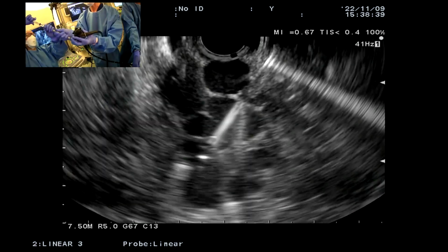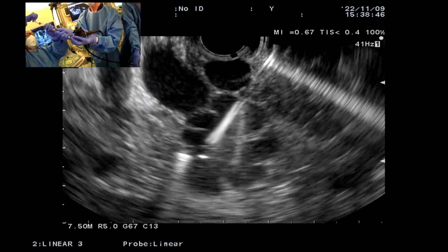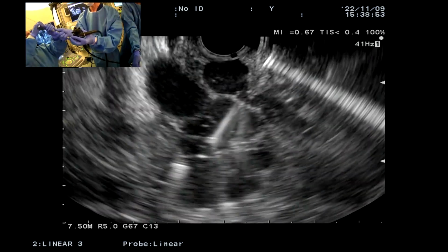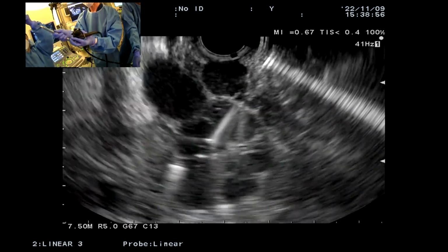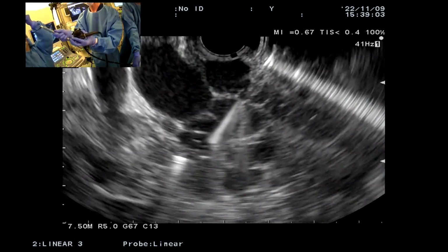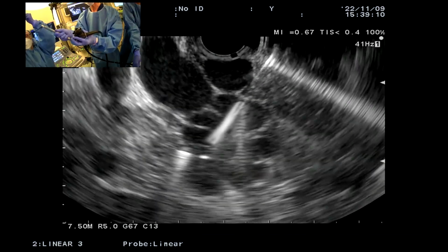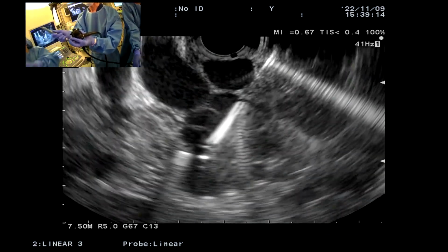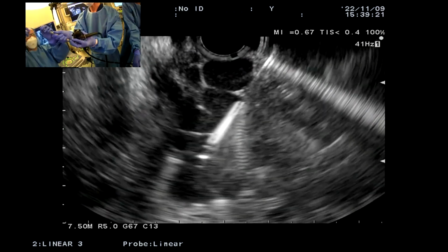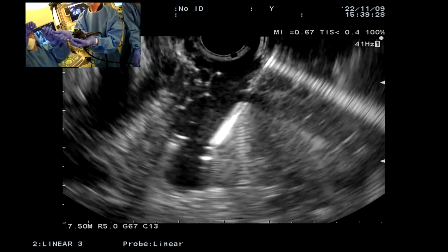Yeah. So it's always good to just confirm you haven't slipped out. Got blood return there. One more time, a little bit of flush just to make sure the lumen, see it's still easily going into the neighboring collaterals. That's no doubt part of the renal shunt there, what you're seeing to the left side. So these are spontaneous shunts that the body very intelligently creates to decrease the portal hypertension. So these are spontaneous shunts, and you don't want to occlude those shunts. It's actually counterproductive to what the body is trying to do.